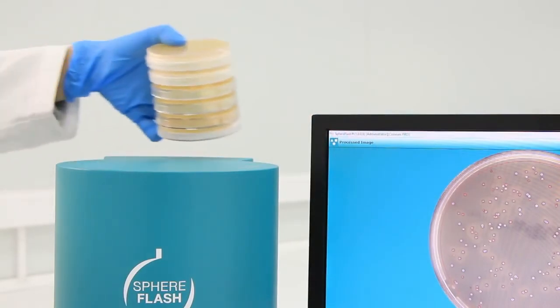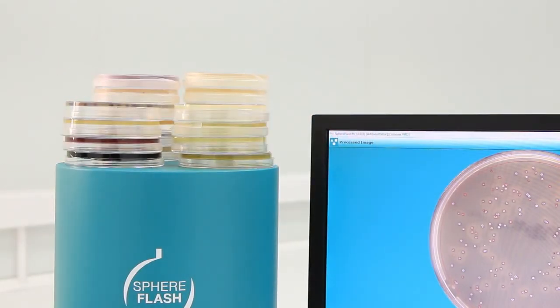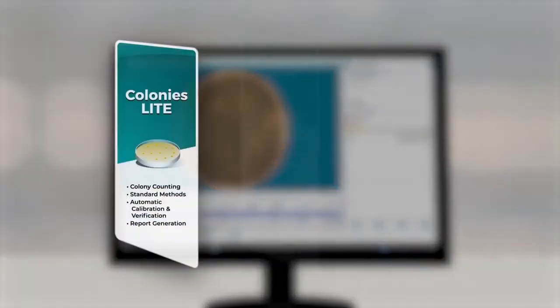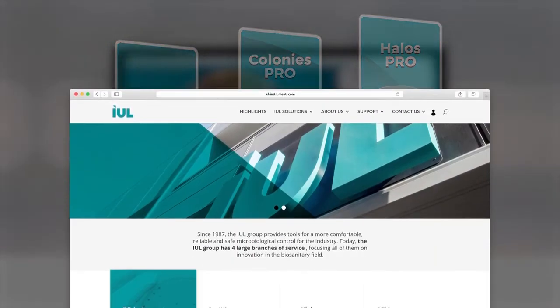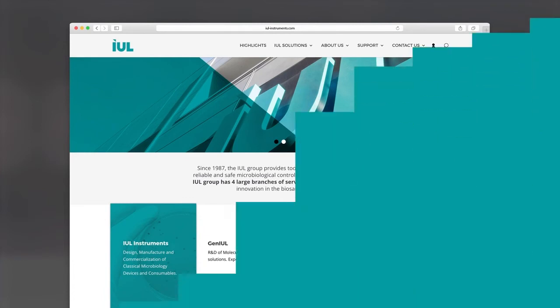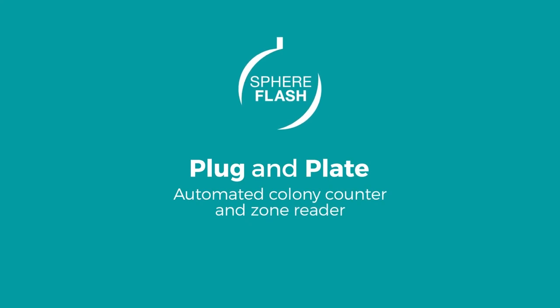We understand that resources are limited, so we designed the SphereFlash with a small footprint and scalable software. Use only the features you need and add new capabilities as your lab work demands it. The software is always available on our website. SphereFlash — the plug-and-plate colony counter from IUL.